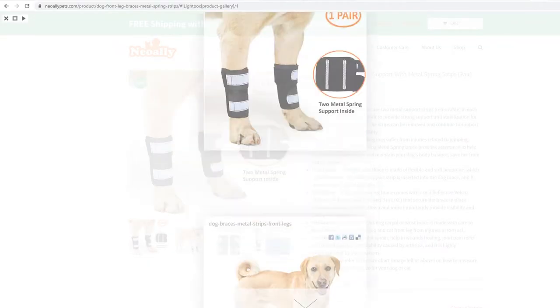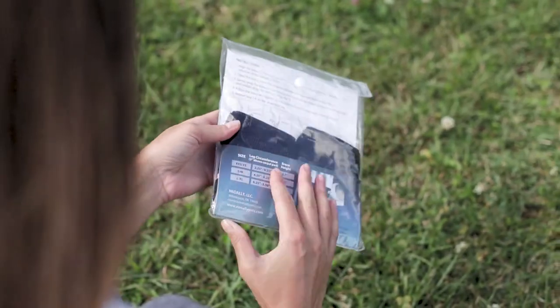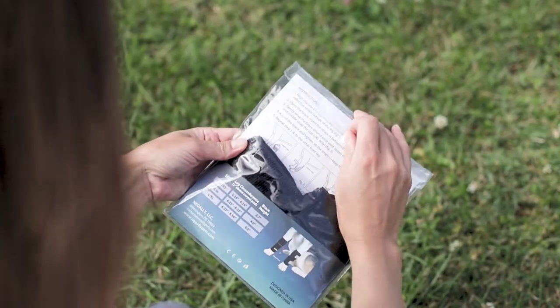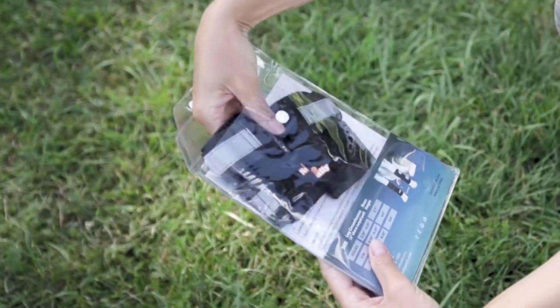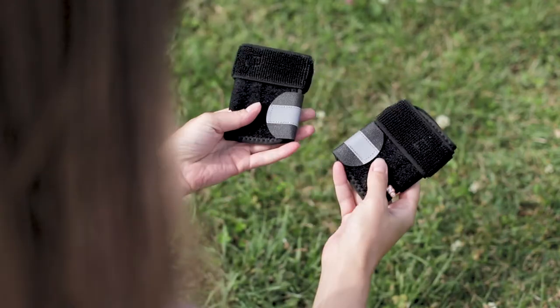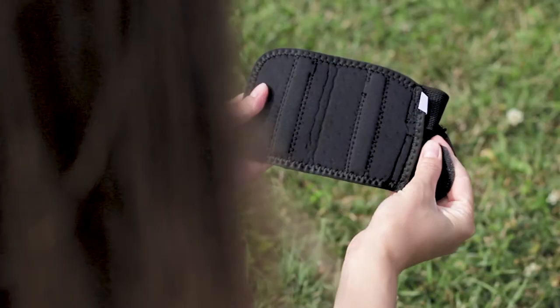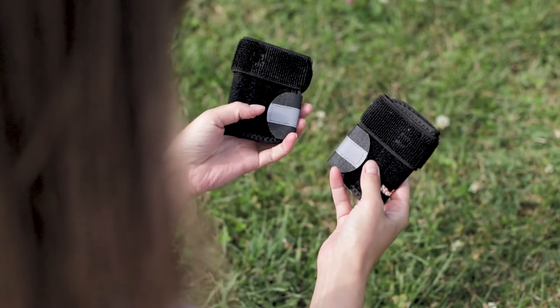Scroll the image carousel to the size chart and choose the correct size. Neo Ally front leg braces come in pairs to support both legs. When a dog gets injured in one leg, it's highly likely the other leg will get injured as well due to the imbalance caused by the injured leg.